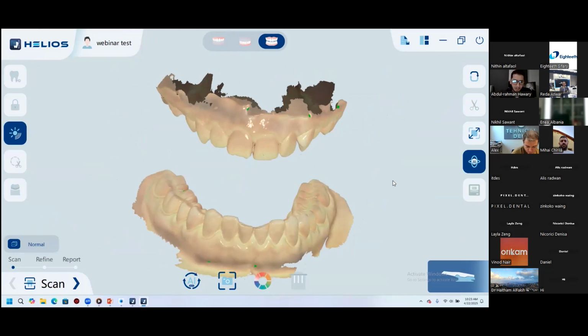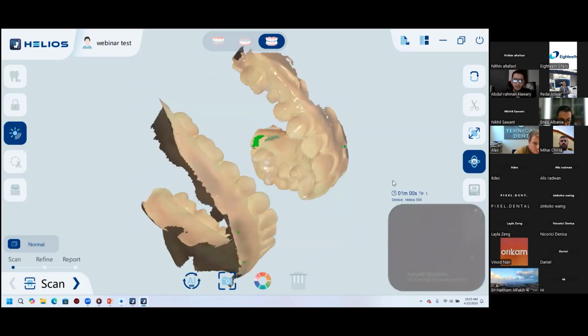and scanning speed. Between each update, you do not notice huge differences from one version to the other. But if you take a version 3 versions earlier than this one, you will detect a huge difference that the R&D team is working on to improve the scanning experience, and to improve the scanning accuracy and smoothness with every new update.